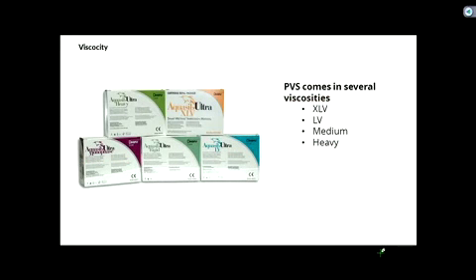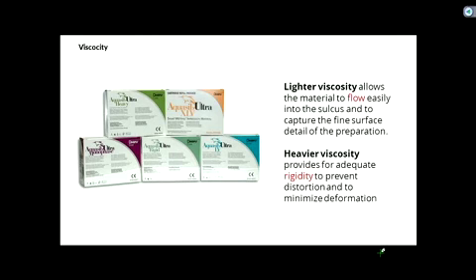So the PVS in the clinic will have an extra light viscosity, that's this one. We have a light viscosity and a heavy, or a medium and a heavy. So lighter viscosity allows the material to flow easily into the sulcus and capture the fine surface detail of the preparation. And a heavier viscosity provides adequate rigidity to prevent distortion and to minimize deformation. So you've got a heavier material in the tray so that once it sets, it's much more rigid.